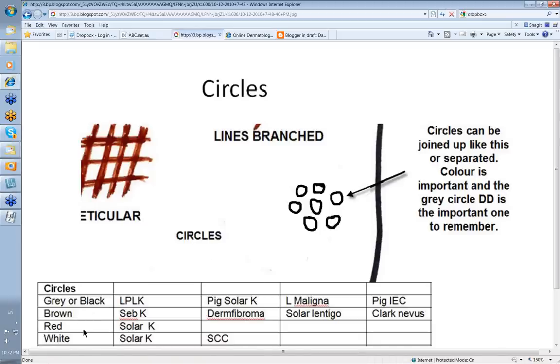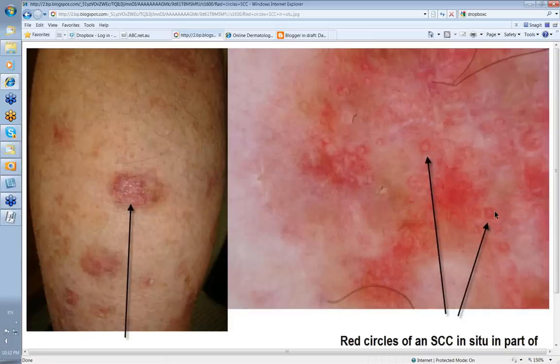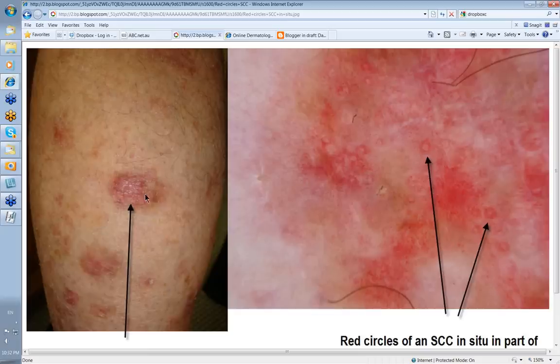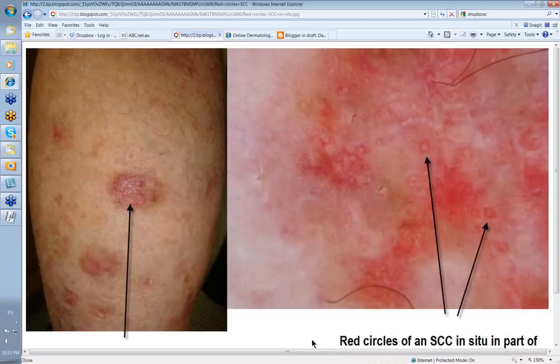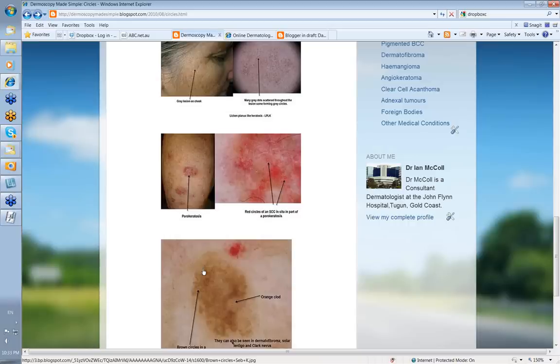What about some of the others? You can get red circles in solar keratosis and in some SCCs as well. Note white circles as well — also part of solar keratosis and SCC. Here you can see very definite red circles. These lesions are actually porokeratosis — you can almost see the cornoid lamella around the outside. But within this, a patient had developed an SCC in situ. So these were red circles seen within a porokeratosis as part of an SCC in situ. Remember, they can also be seen in ordinary solar keratosis, as can white circles.